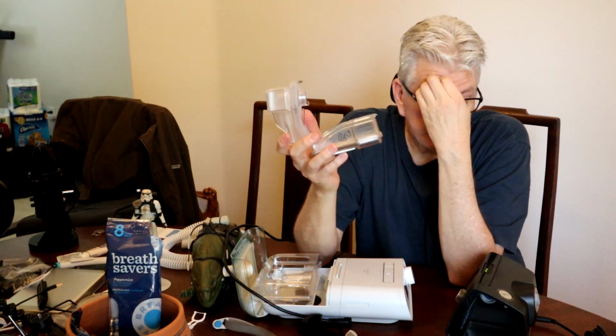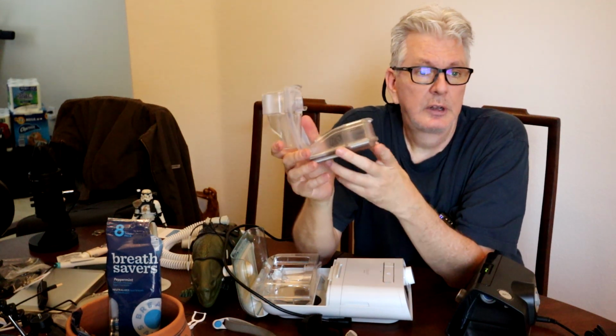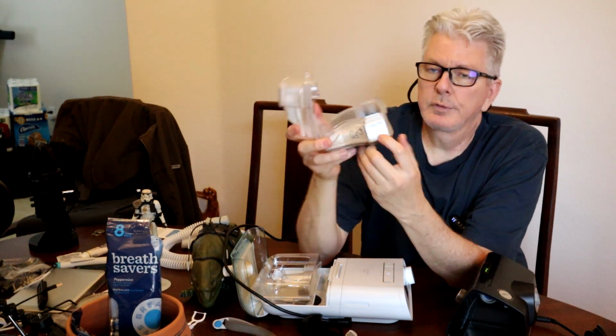And the more you use these machines, you kind of know how much you use in the course of a night. Depends on your humidity settings, depends on how long you're wearing it, how high you have the heat. Do you have heated tubing? Do you have standard tubing? So they have, on this one, a minimum and maximum level, and you just kind of figure it out.